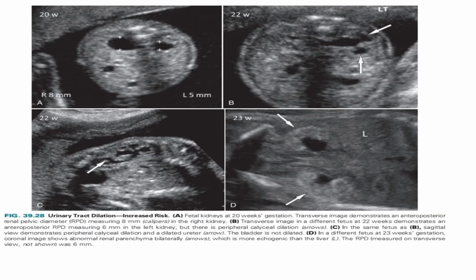This is the increased, high risk group. At 20 weeks of gestation, it should be less than 7 mm for a low risk group, but it is more, it's 8 mm on the right side, hence it comes under high risk group.